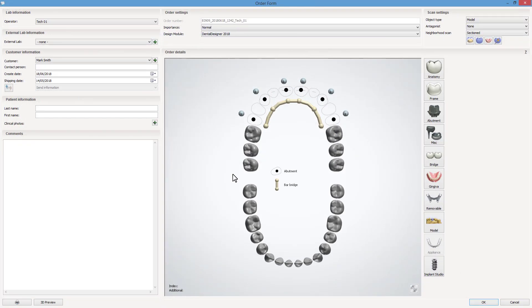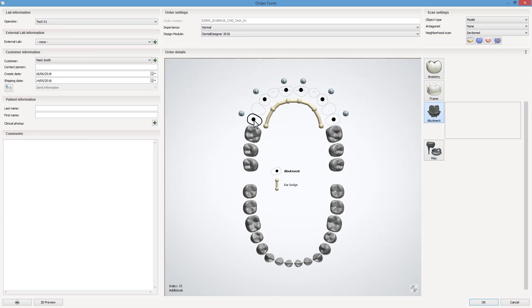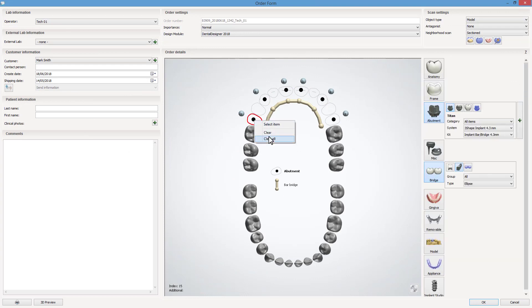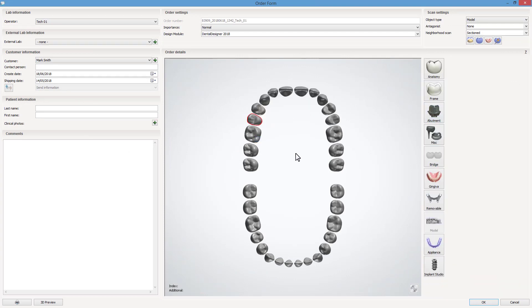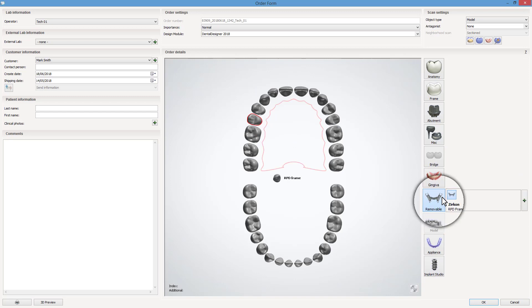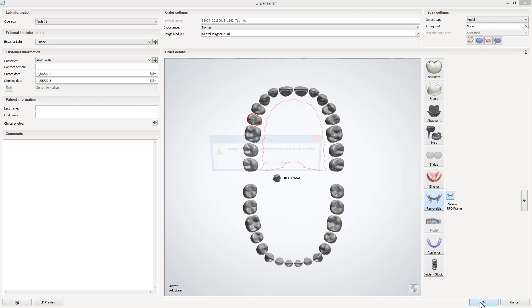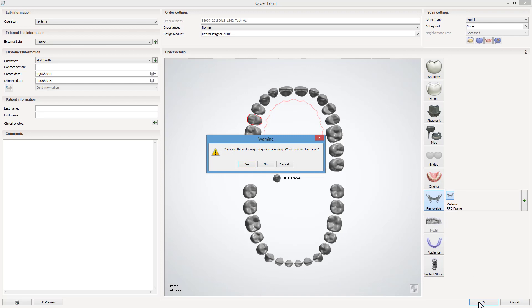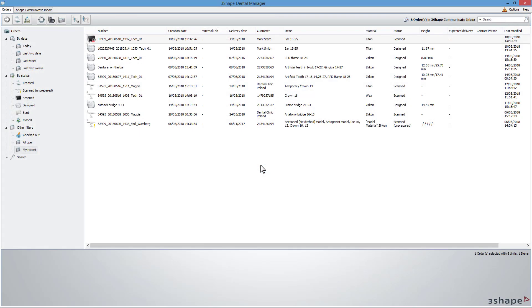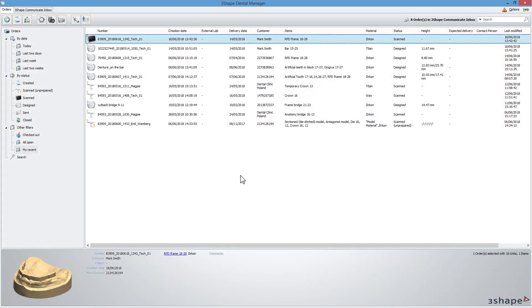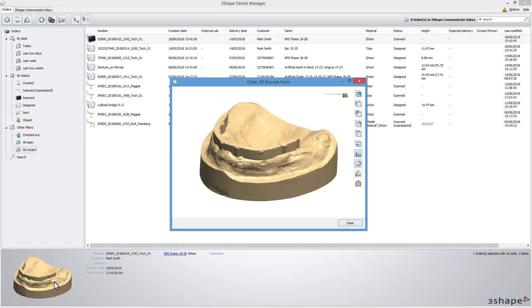Open the order form and modify the indications. The bar is already designed, so what you need to do now is clear all indications, check if any tooth is selected, and click on the Removable tab. Click OK. The software will ask you if you want to rescan — choose No. The bar is now connected to the base of the model, and you can start designing the secondary construction.